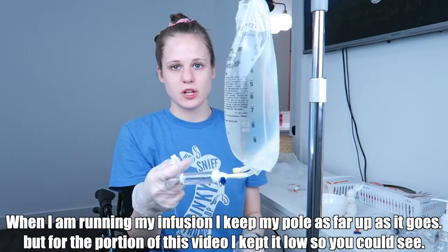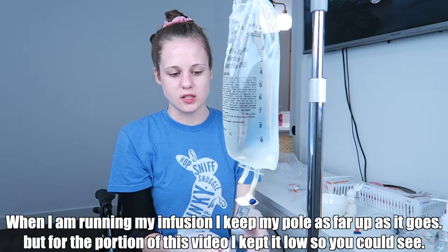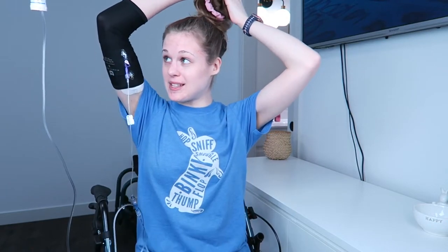All right, so I'm gonna go ahead and unclamp this, and you'll see it starting to drip here. Okay, I'm not sure where it cut out, but basically I just throw everything away. And yeah, that's basically it. I just kinda hang out and chill while the rest of the infusion goes. I'm gonna take my hair out because I hate having my hair up. It looks so crazy. But yeah, that is basically it.